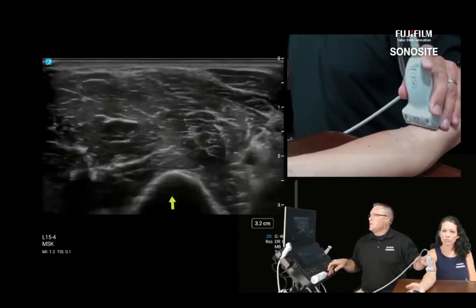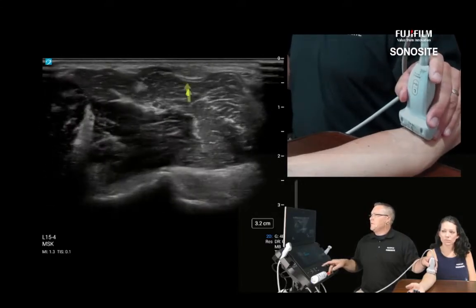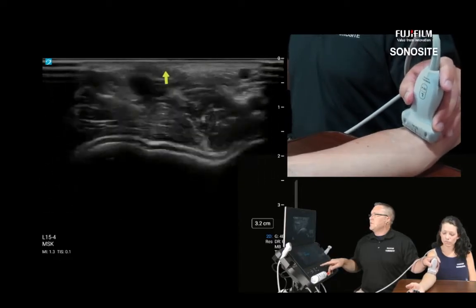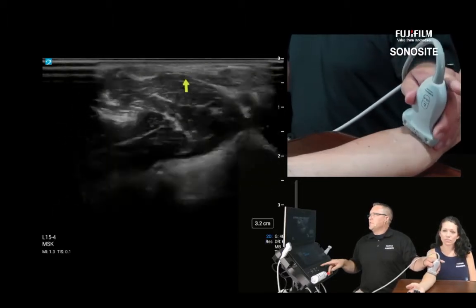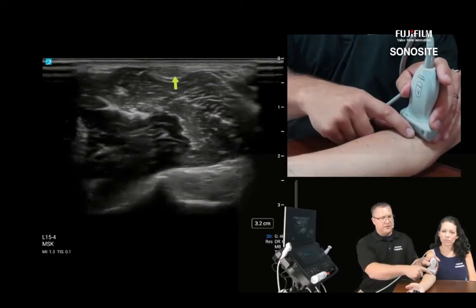Now to the cross-sectional superficial structure, which I think needs the most attention in the anterior elbow. Most people are most curious about this distal biceps tendon exam, so we're going to focus a lot of time on that today. If you're fairly new at this and you're just getting your bearings as to where we are on the screen, the distal biceps tendon is really nice to scan because you can feel it.